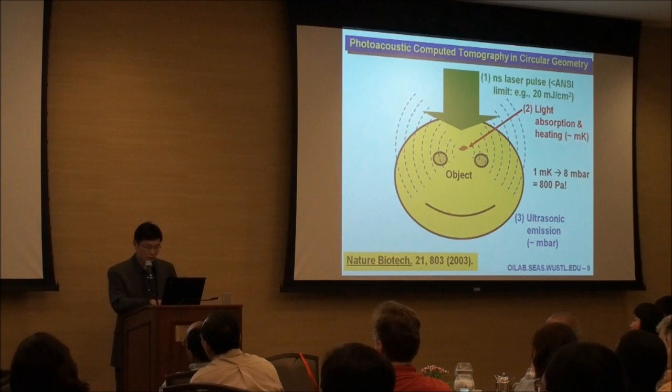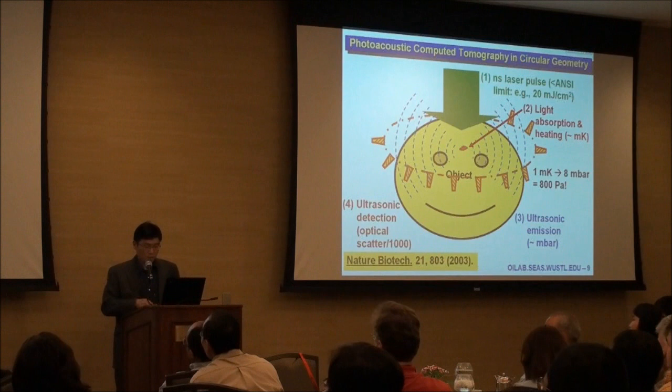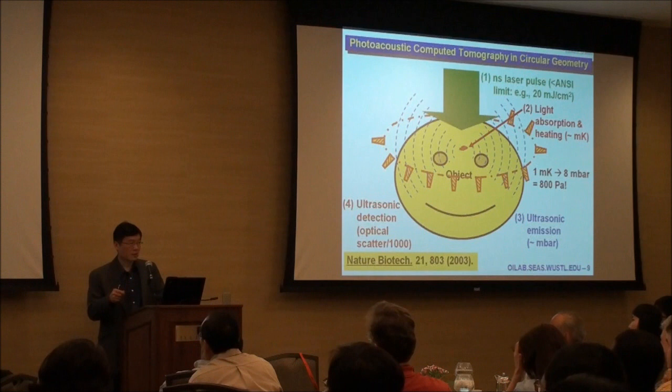When the sound propagates out of the tissue, we place ultrasound transducers outside to receive the signals. From there on, it's a mathematical problem. So you can reconstruct the image by solving the math.